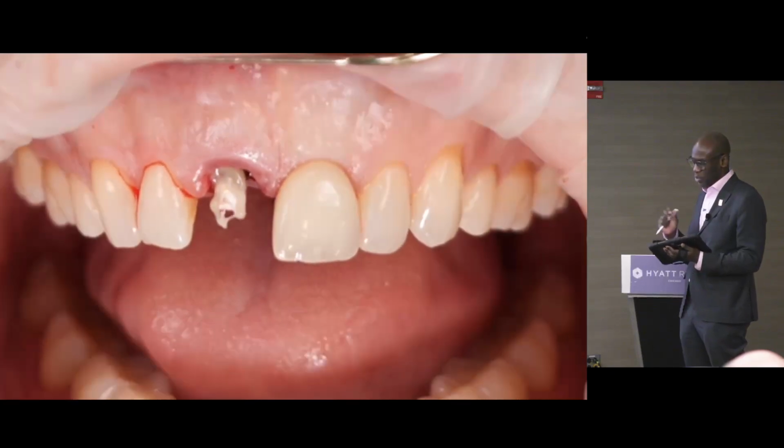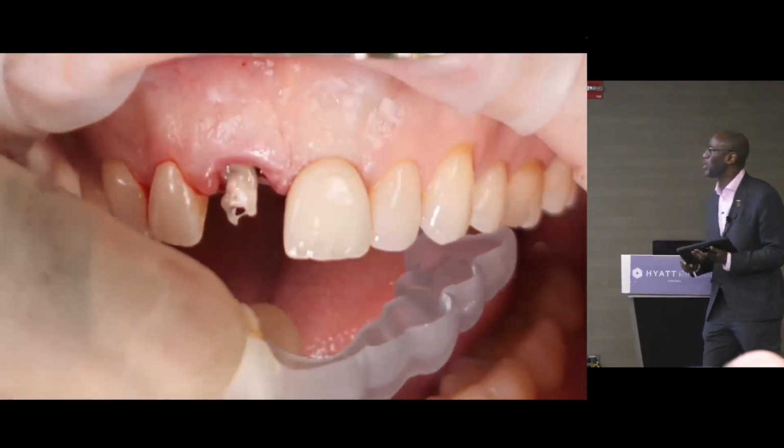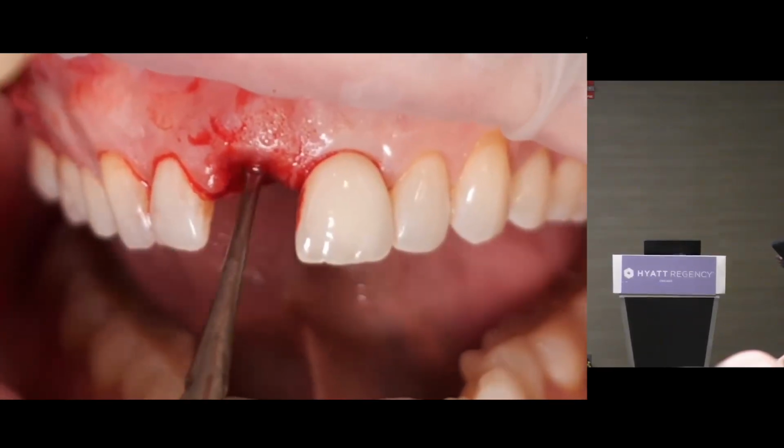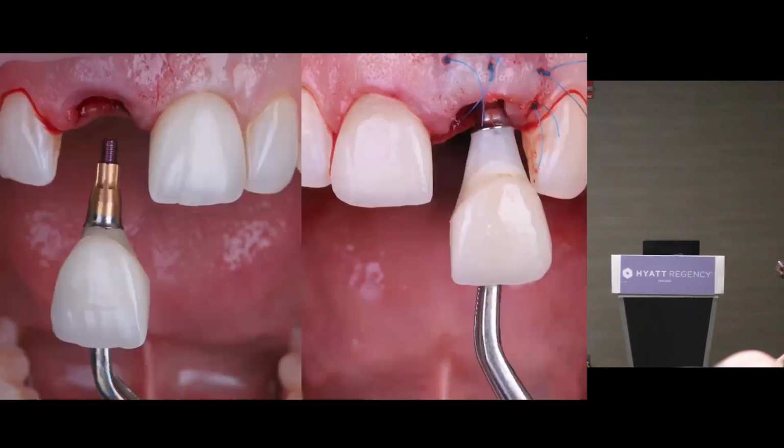And from that pickup, we then put the crown back into place and just proceed from there. So again, there's a few bits we'll touch on in other cases that we'll show. Again, just go through the pickup. I won't spend too much time on there. And really to show you that when we come to fit it, this is it.